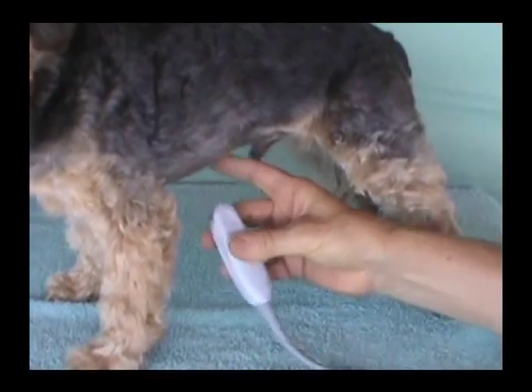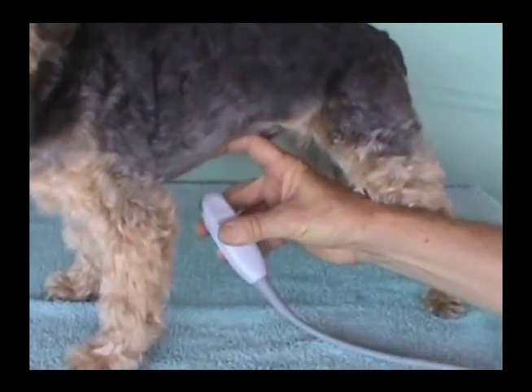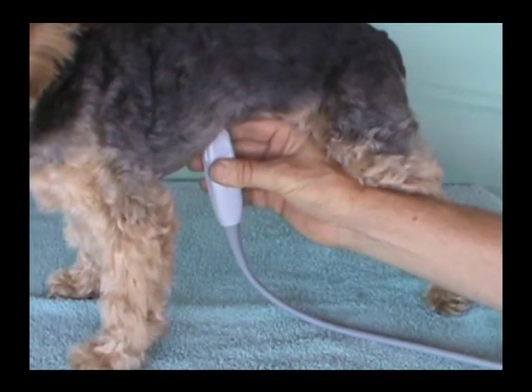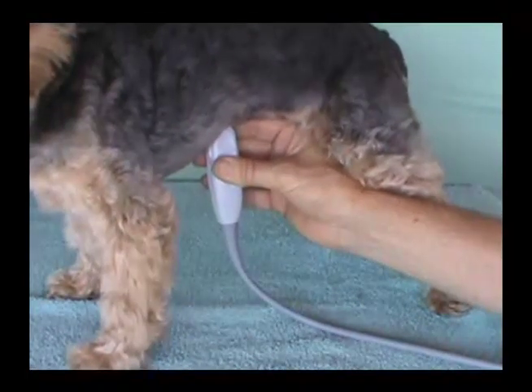If you're using an alternative grip, anchor the index finger to the patient's body, and then anchor the transducer to the index finger.